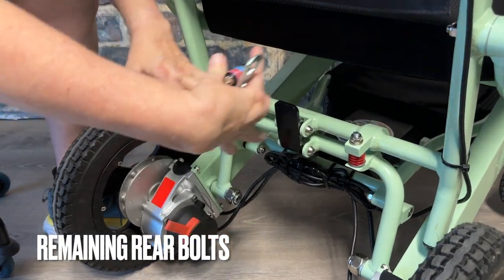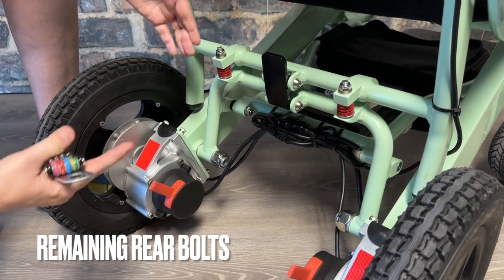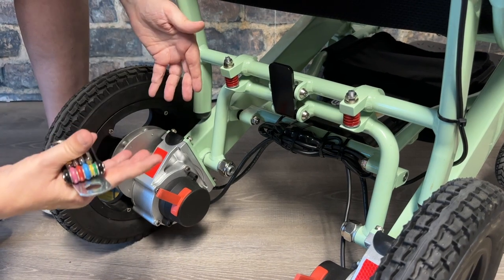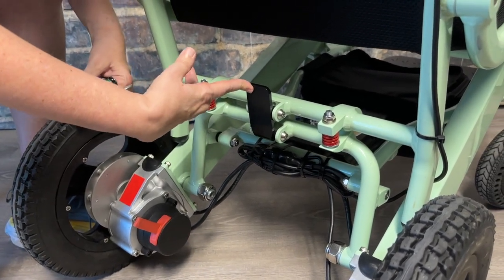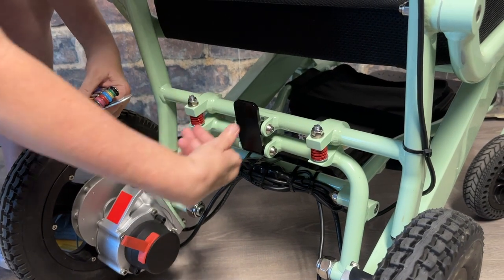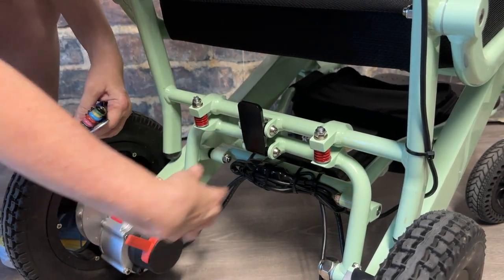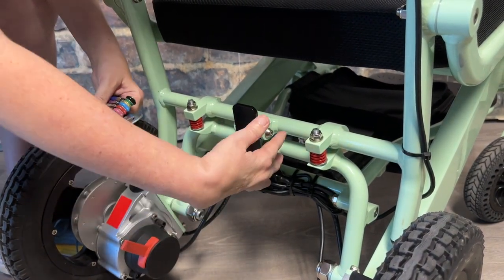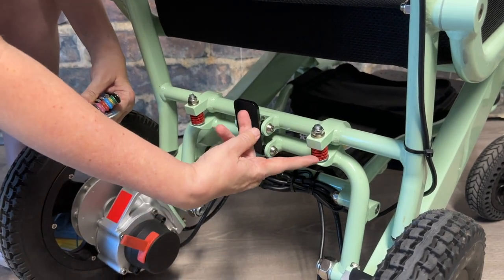To wrap up tightening the bolts, we have the rear remaining bolts — most of these you will not have to tighten monthly, but you do need to spot check them. First, check the frame lock: when the chair is unfolded, you should not be able to unlock it. If the lock is too loose, tighten the bolts on both sides that hold the bars of the frame lock.